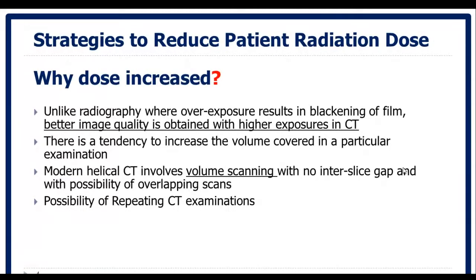Considering this point is very important, because we always need to balance between patient dose and the level of quality required to diagnose a certain problem. So we are not seeking high quality images; we always mention that we need to think about optimal or acceptable image quality that will support the purpose of diagnosing a certain problem.